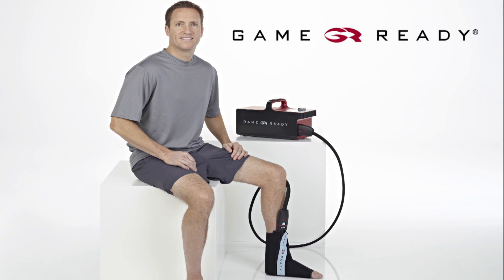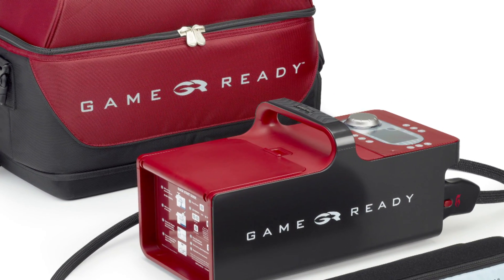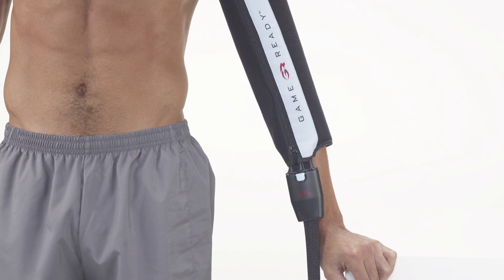Welcome to the GameReady elbow wrap application video. GameReady uses ACCEL technology to apply cold and active pneumatic compression therapy, designed to help you recover from your injury or surgery as quickly as possible.